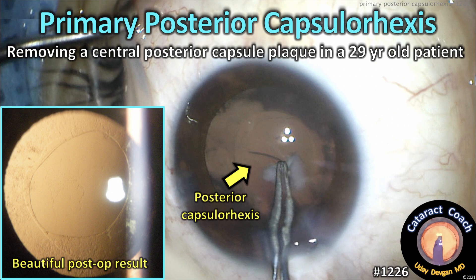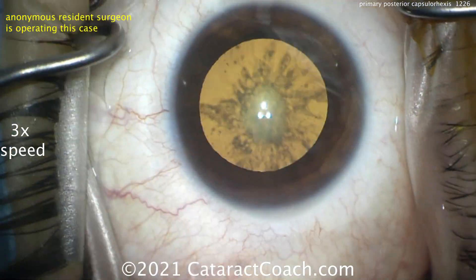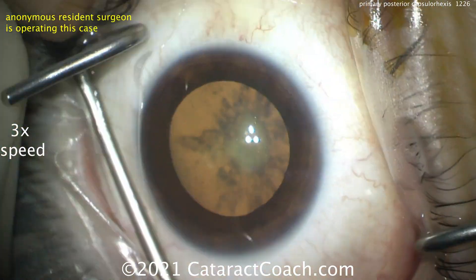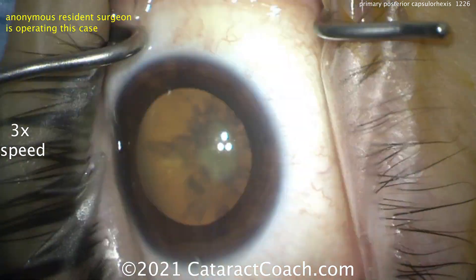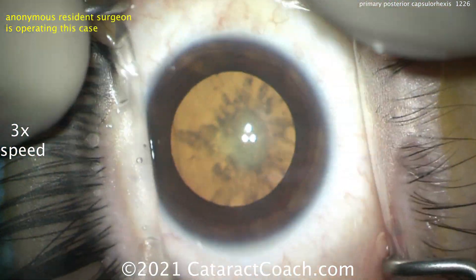CataractCoach.com presents a primary posterior capsular rexis — removing a central posterior capsule plaque in a 29-year-old patient. Here's the cataract. You can see it's posterior subcapsular with a lot of opacity right there in the absolute middle. We're showing you the video at three times normal speed so we can get through the whole thing.